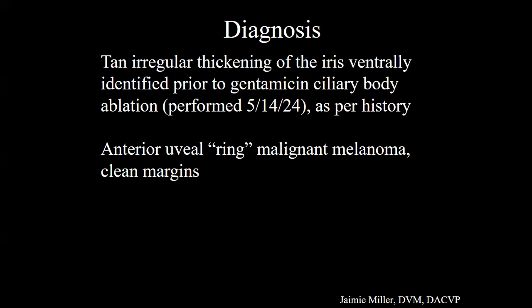What were the cells surrounding the optic nerve? Was that just meninges or was that tumor? It was just meninges. The tumor was completely excised. But Dr. DeBilzig is hard at work as we speak here. He just sent a text. If you guys haven't seen on the chat, 20 out of the 25 melanomas with gentamicin injections in their database are malignant. So, poking the bear.